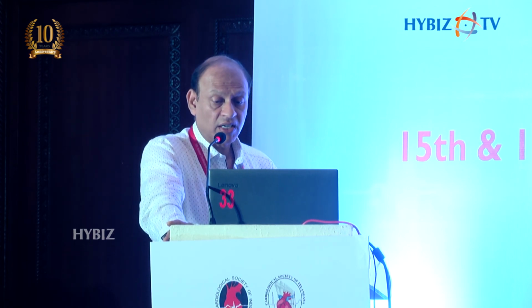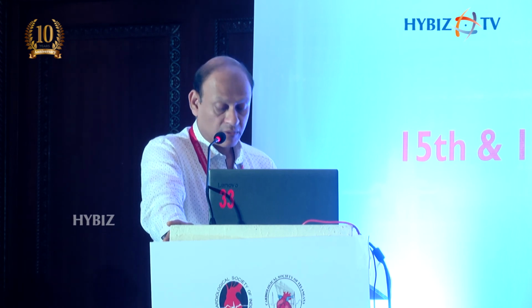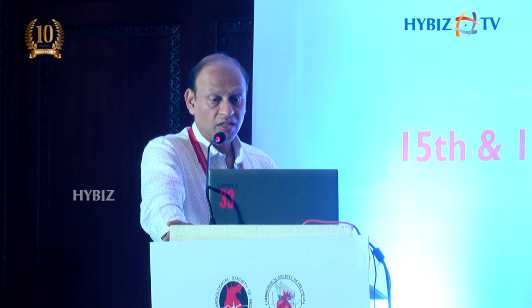Another trial has very clearly shown that smaller final lumen area, tissue protrusion, edge dissection, and residual stenosis decide the outcome. One of the important advantages of using OCT or intravascular ultrasound guidance is that your duration of DAPT can be shortened when you have an excellent deployment of the stent. This is the ADAPT-DES study, which has very clearly shown that angiographic guidance gives a higher MACE when compared to imaging-guided PCI, and the duration of DAPT can definitely be reduced in this group of patients.